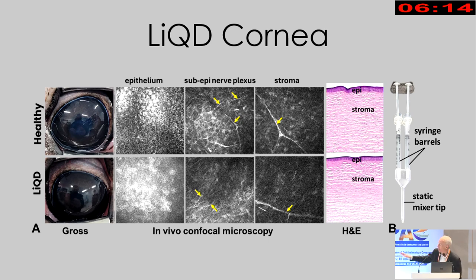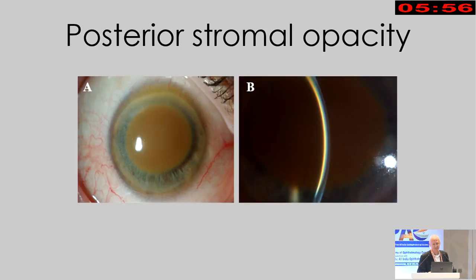You see normal cornea along the top pane here, and the lamellar defect that's been filled with a gel, a bit like using a dental filler, and then you get cellular regeneration into that framework and nerve regeneration as well, and a normal epithelium too. That's not too far away from clinical trials now, I hope.